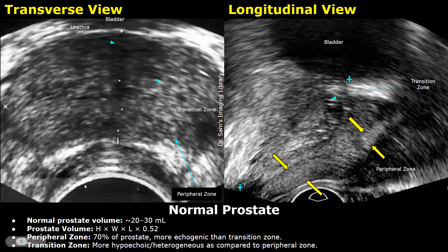The TRUS images are inverted — the ultrasound probe is at the bottom of the image and the rectal wall is just anterior to the probe. In the transverse plane, this larger echogenic structure is the peripheral zone of the prostate, and this smaller hypoechoic structure is the transition zone, which can also appear heterogeneous. In normal cases, the peripheral zone occupies the majority of the prostate.